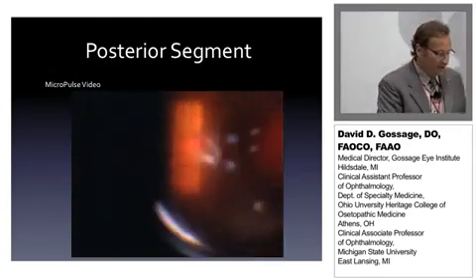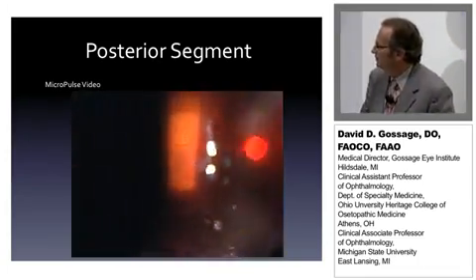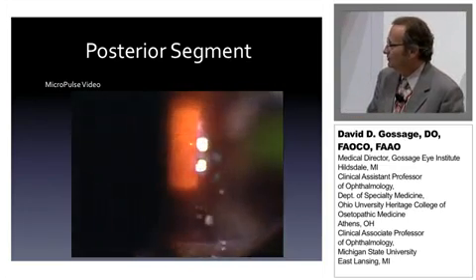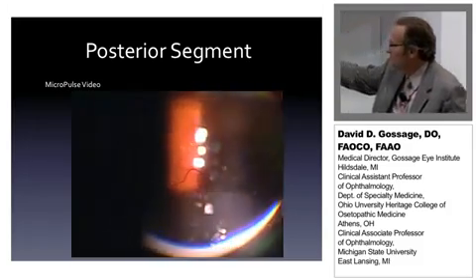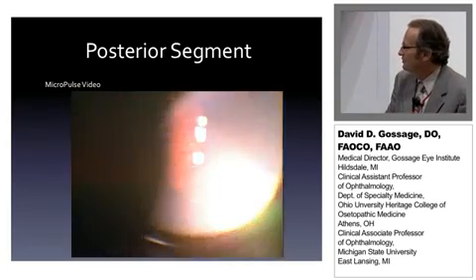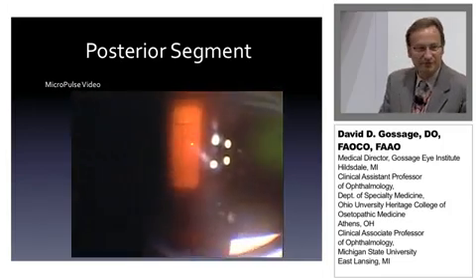So this would be a video about how the treatment would take place and look. I apologize, I was by myself that day. Usually the residents are doing all these treatments for me, but you can see how with the MicroPulse mode, you just treat in a kind of paintbrush technique, going across and applying that laser energy in a grid fashion.